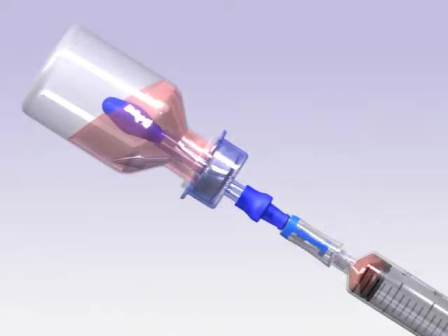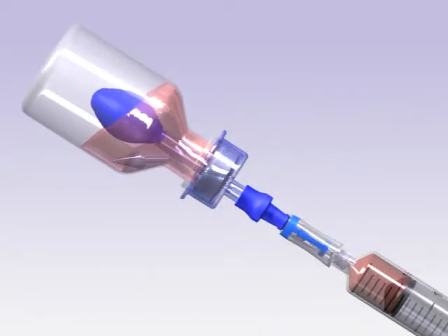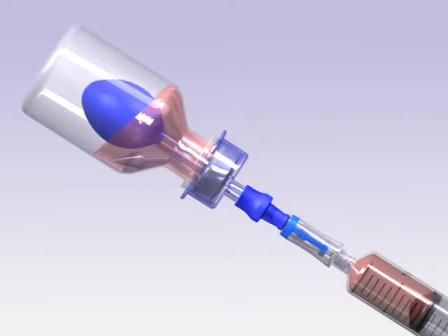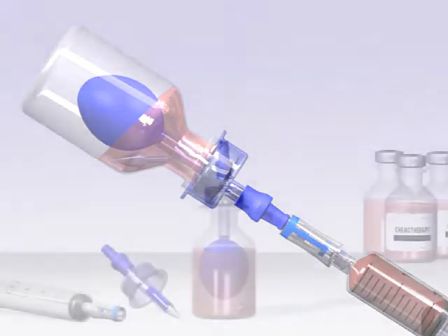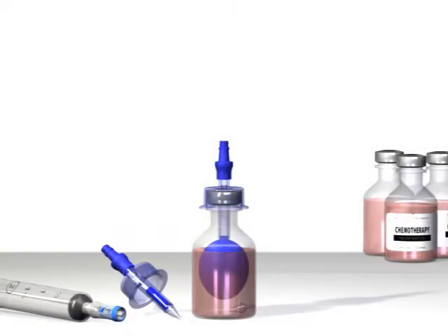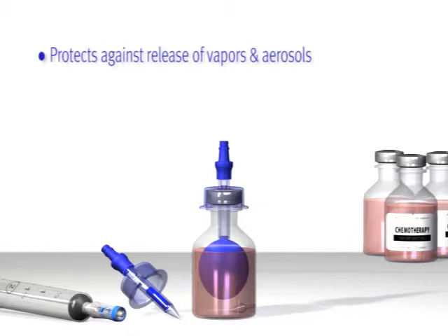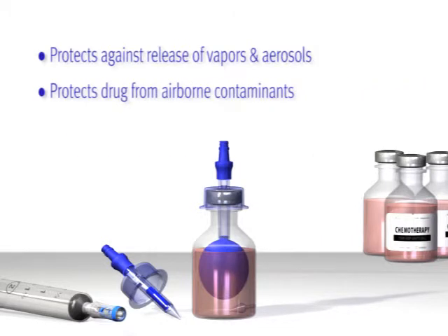To do additional withdrawals, simply swab the clave again and repeat your procedure. The Genie will inflate each time to equalize the pressure. The Genie protects against release of vapors and aerosols into the environment, as well as protecting your drug from airborne contaminants.